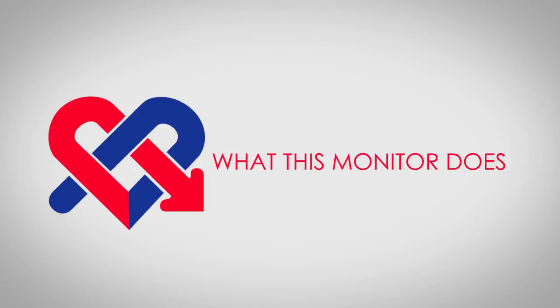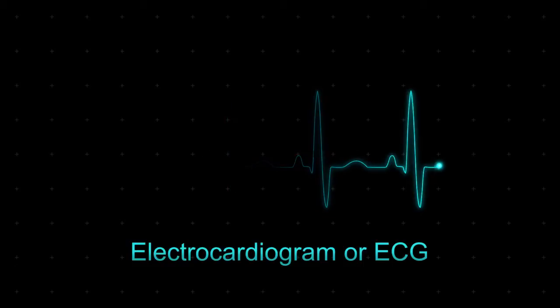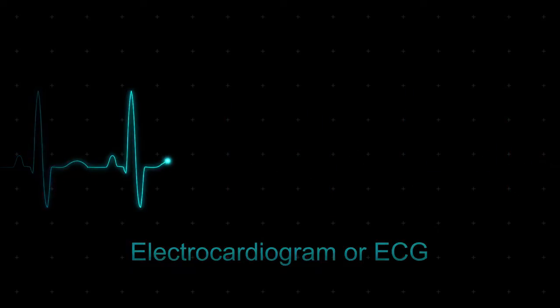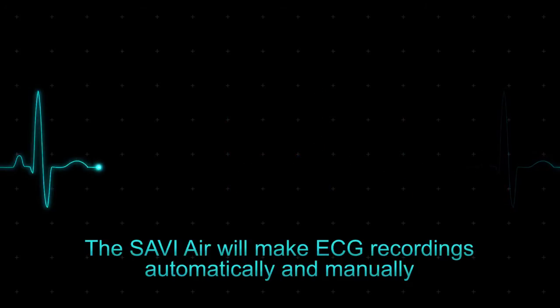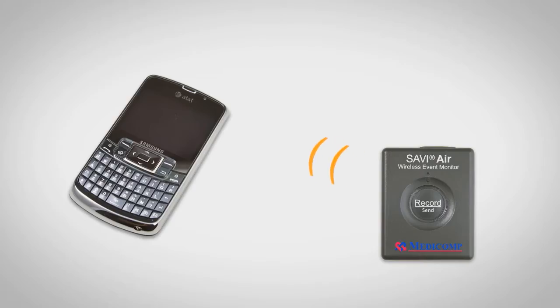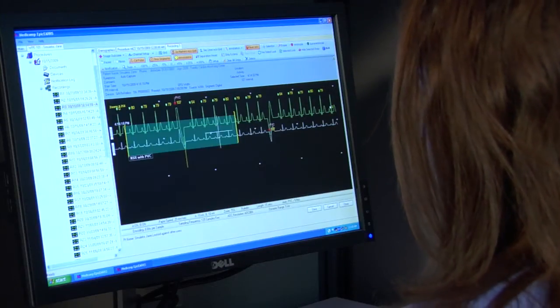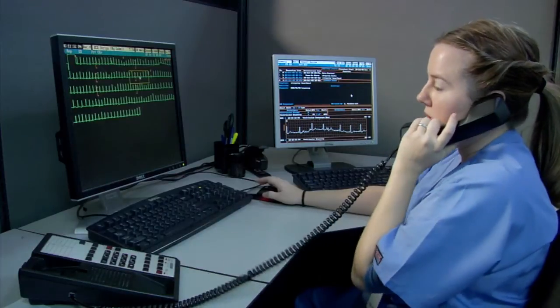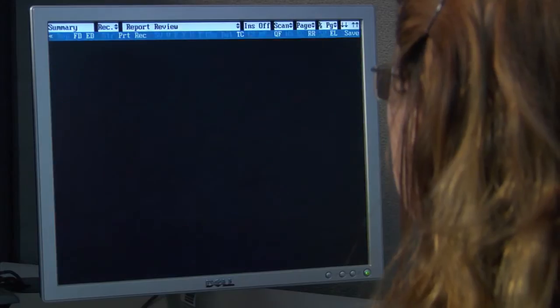What this monitor does. Savvy Air will allow you to record your own electrocardiogram, commonly known as an ECG, when you feel a symptom. The monitor will also make an ECG recording on its own, automatically, without your interaction, whenever it detects a possible arrhythmia, even when you don't feel a symptom. Your ECG recordings will be sent wirelessly via the cellular network to one of MediComp's 24-hour cardiac monitoring centers. Our team of cardiac specialists is on hand 24 hours a day, 7 days a week to receive and review your ECG data, and then compile detailed reports for your doctor.